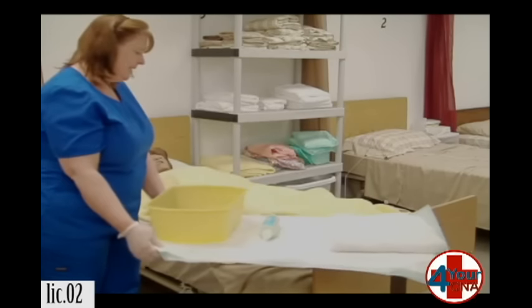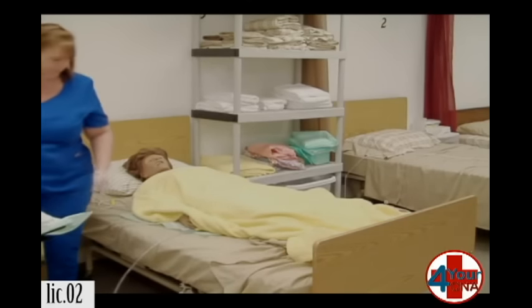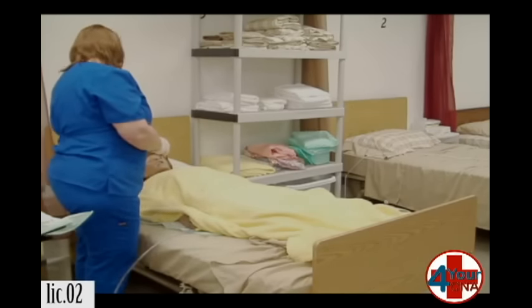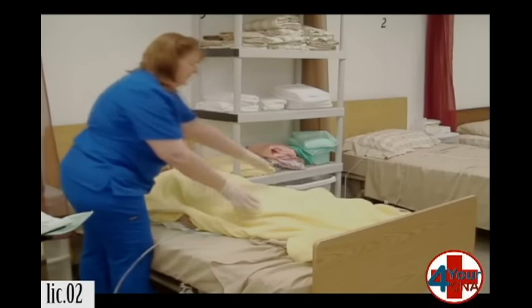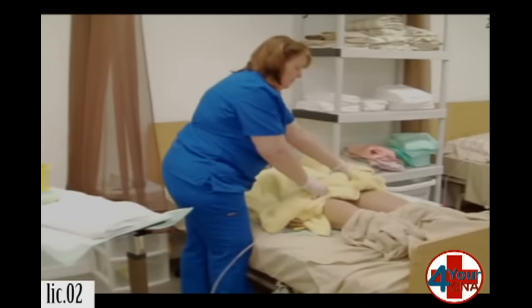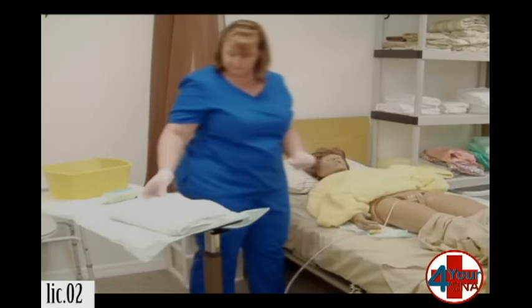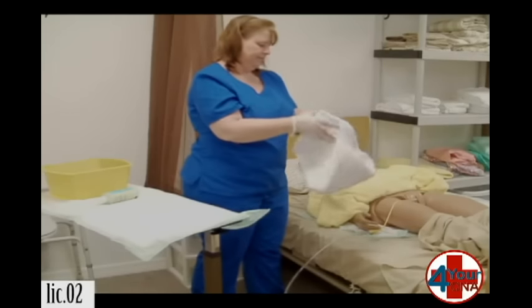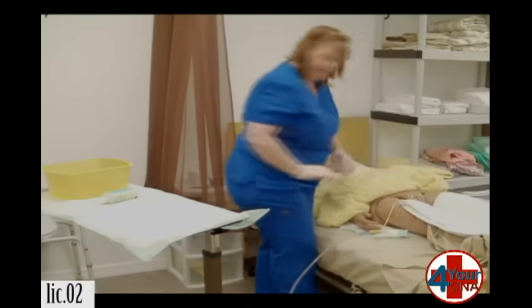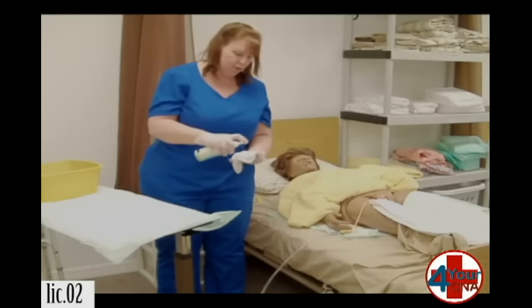I'm going to put my washcloths in the basin. Ms. Jones, I'm going to pull the blanket up. This is going to expose you. I'm going to make this as brief as possible. Please let me know if you're uncomfortable. I'm going to lay this over your legs. I'm going to get a washcloth, wring it out really well, and I'm going to soak four corners.